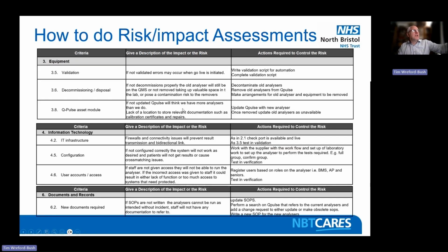Here's a few more slides. Validation: if not validated, errors may occur. Write validation scripts. There's the actions.